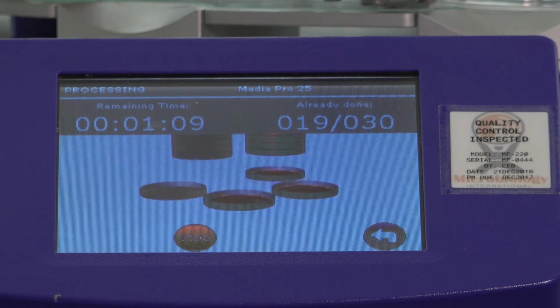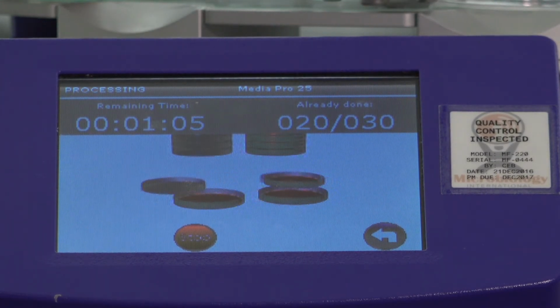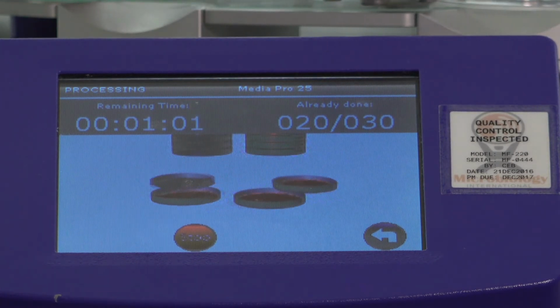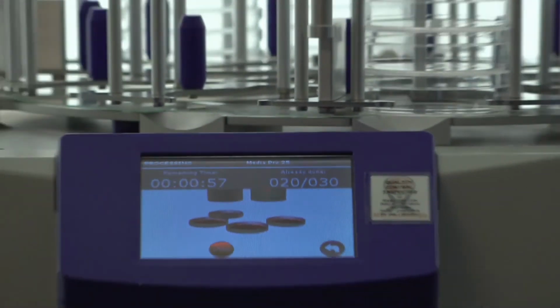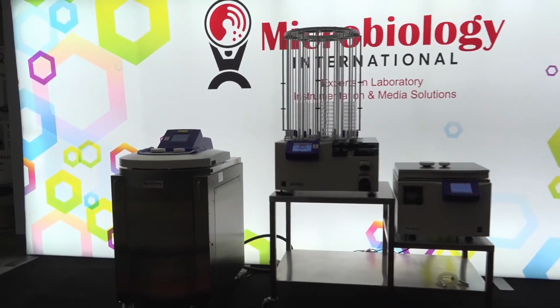So we're just going to adjust a little bit and move back to give an overview of the instruments again. And once we do that, I'm going to finish up with a little bit of a PowerPoint presentation just to finish that out. And then we will move forward with any questions that you may have.